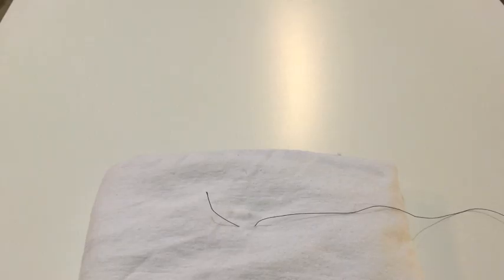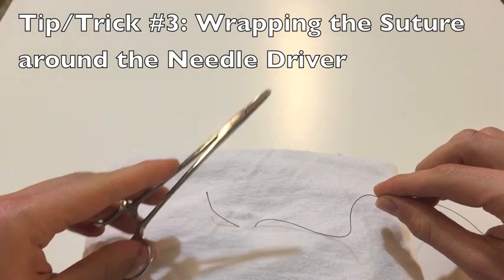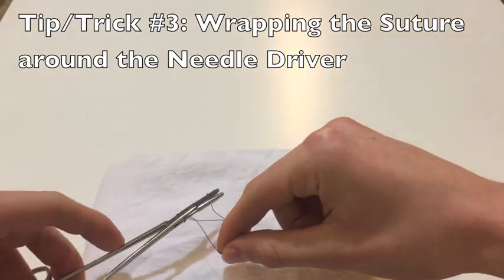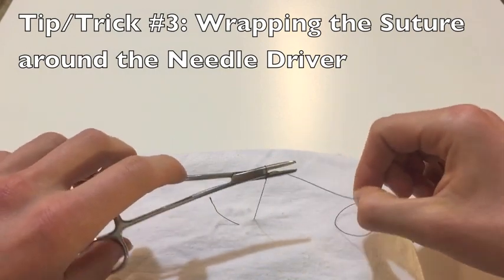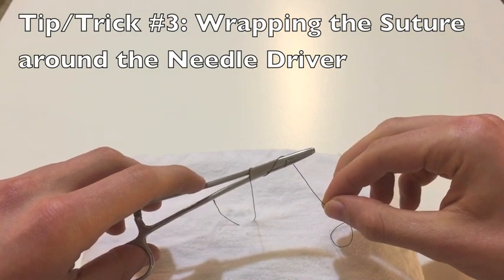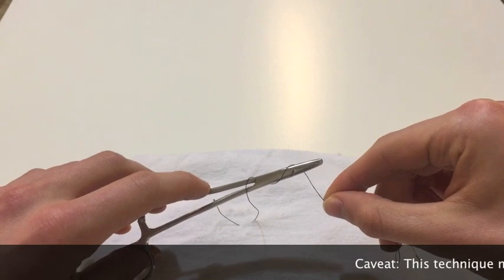My third trick is going to be how to wrap the suture around your needle driver. I've seen some videos online where they'll hold their needle driver up in the air, bring their suture up to them, and then use that needle driver to create their loops for their first surgeon's knot. I think a defter way is to spin your suture around the needle driver instead — that way you know where the tip is the whole time.